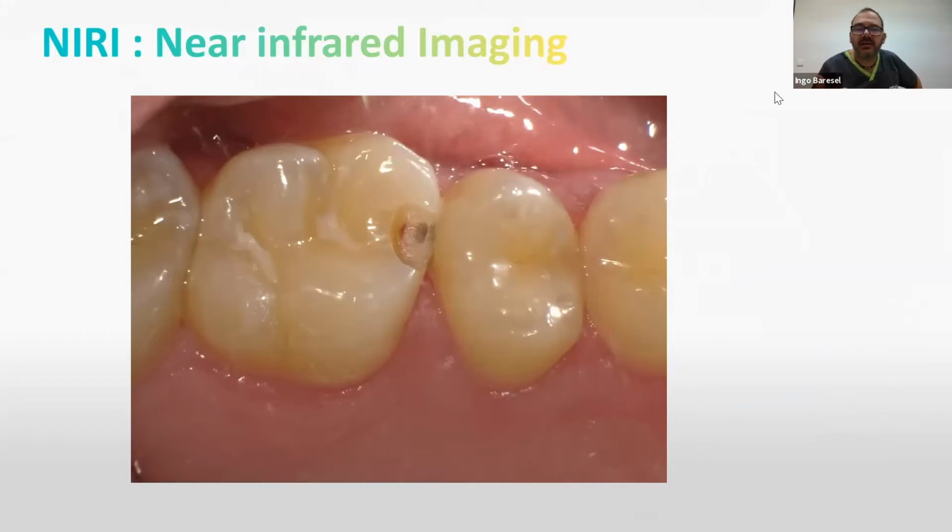In the beginning, when they asked me if it's so helpful for us as dentists to have caries detection in a scan, I said, no, nobody needs this. I have X-rays, I have my eyes, I have other tools, so I don't need this. But luckily, they didn't listen to me, so they built it, and I love this function. I will show you later on live.